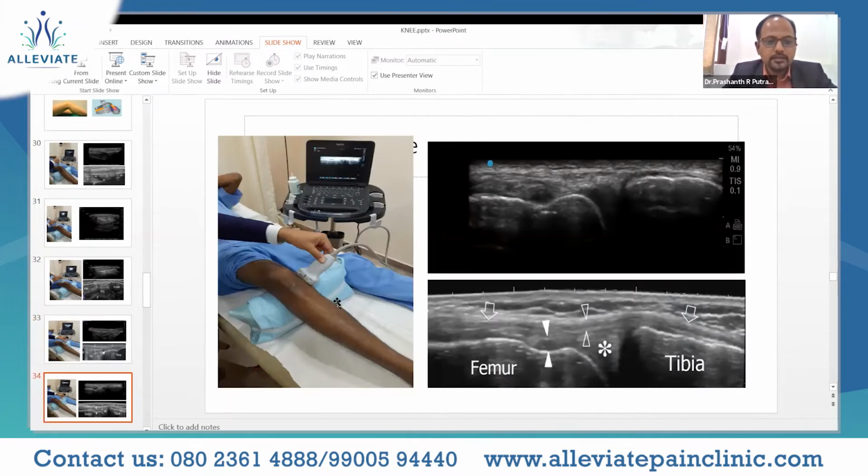Now we can see that we have moved towards the medial aspect of the knee joint. This is the right knee being scanned on the medial aspect right now. We are approaching this area, so we are scanning at this level now. We expect two bony shadows and a portion between them to be visible, and that is exactly what is seen in the image. We have the femoral condyle, the tibial portion, and the joint space in between.